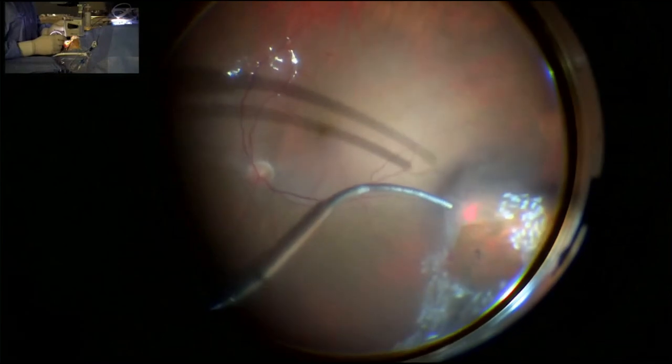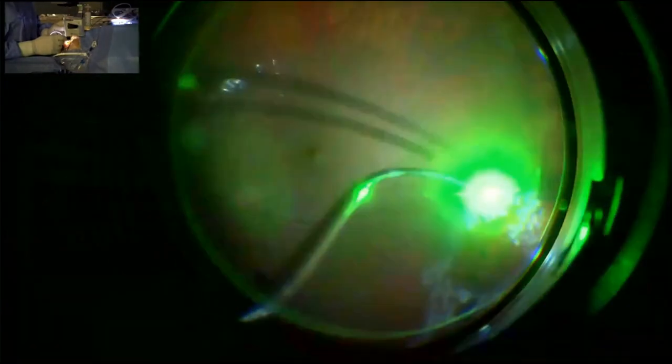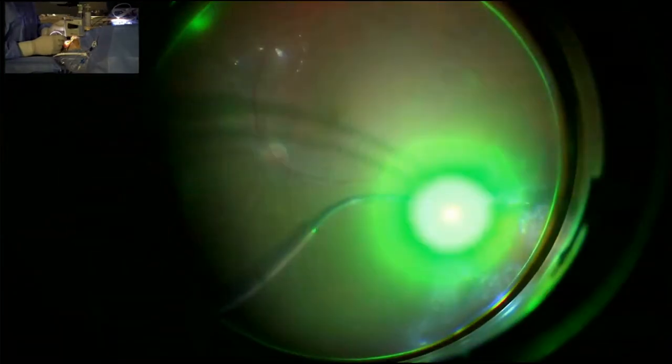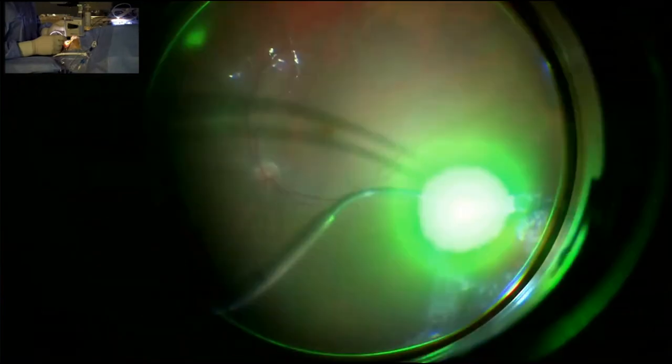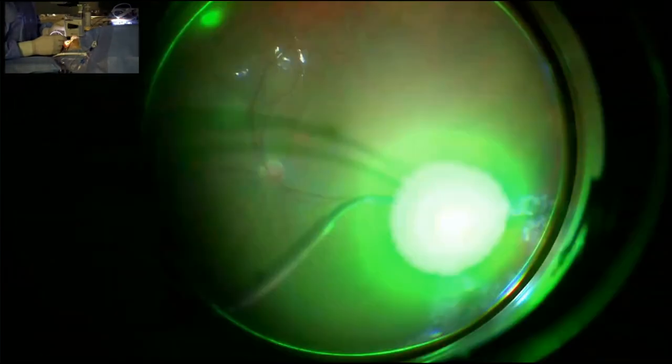So the laser is almost finished. Again, not so many laser spots, only 3 to 4 layers or 2 to 3 layers of laser around the edge of the retinal tear is enough to make a retinopexy after surgery. So light laser. It's almost finished, but we will do laser to the inferior part as at one point there was a small retinal tear in that area.